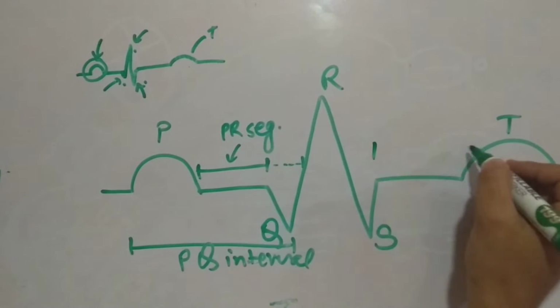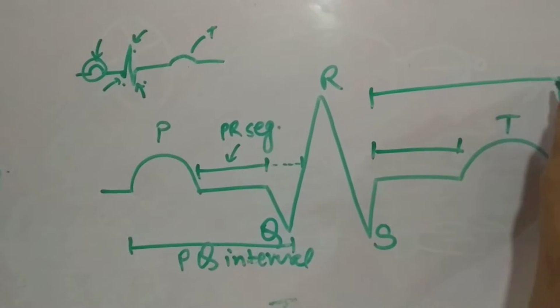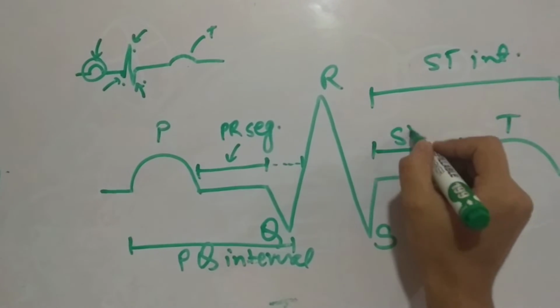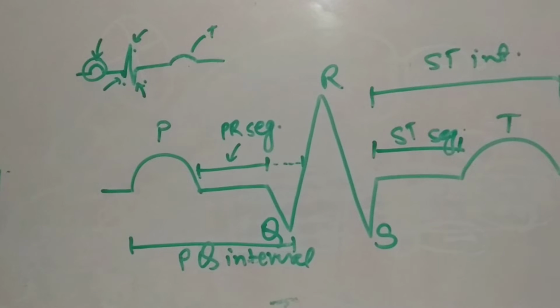Likewise, this is called ST segment. And from here to the end of the T, it is called ST interval. So this is ST interval, this is ST segment. So these are some basic definitions or nomenclatures that you need to understand.